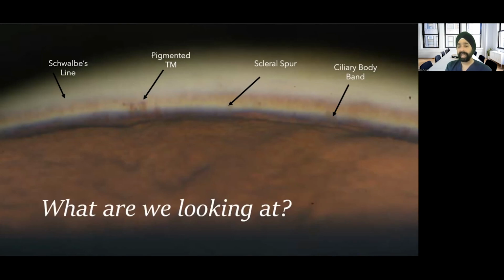But what are we looking at when we're looking at these with these 3 gonioscopic lenses? Well, this is the angle for everybody out there. Important. Everybody who gets an eye exam, in my opinion, should get a baseline gonioscopic examination. Now, if you have glaucoma, it's imperative.